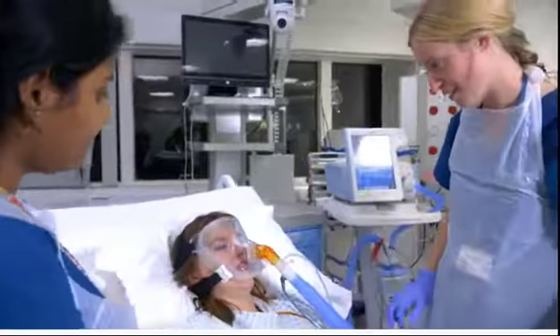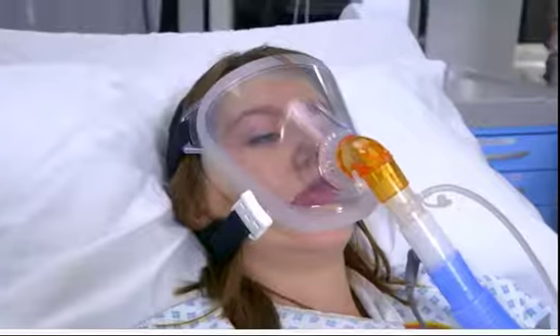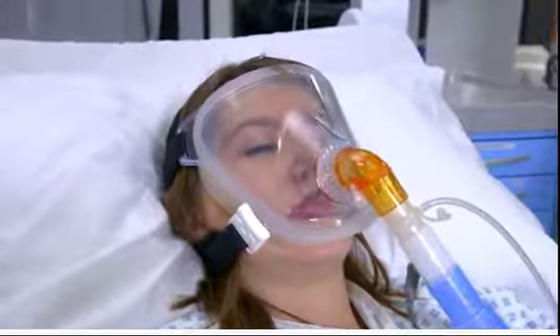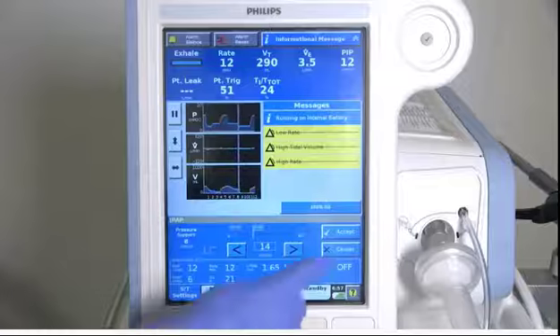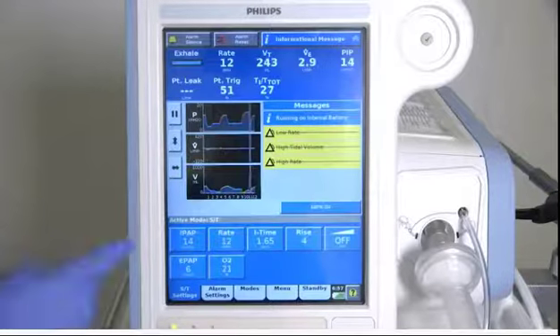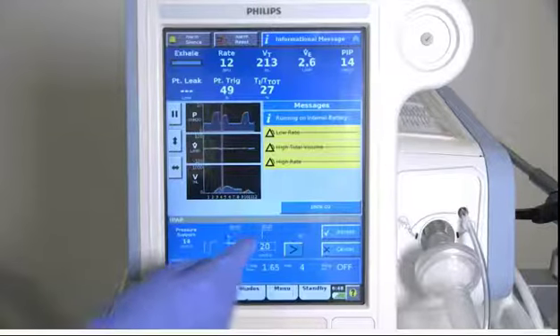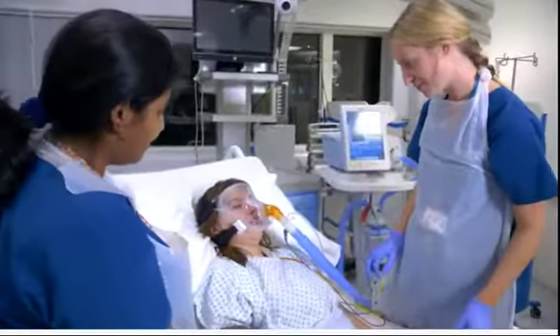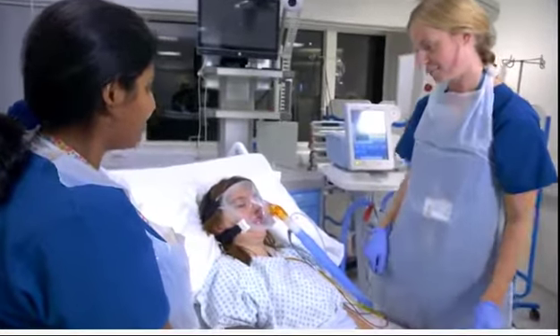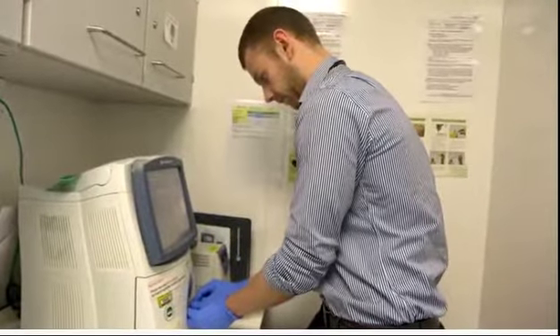The patient should remain on continuous monitoring for at least the first 12 hours of treatment or until the initial respiratory acidosis has resolved. Now the patient has been commenced on NIV, the aim is to increase the IPAP to around 20 in the first 10 to 30 minutes of treatment. If you reach an IPAP of say 16 or 18 and the patient starts to not tolerate, then it's okay to leave them on this setting. After an hour of the patient being on optimal settings, a repeat ABG should be taken. This will allow you to guide your treatment further.